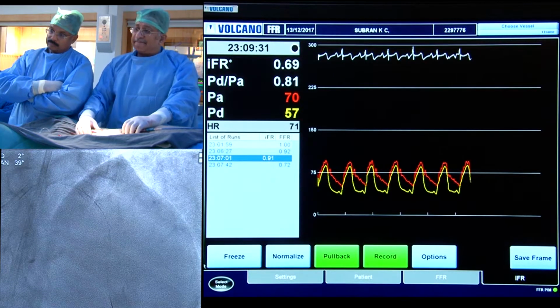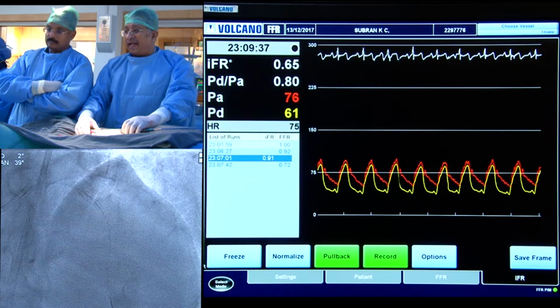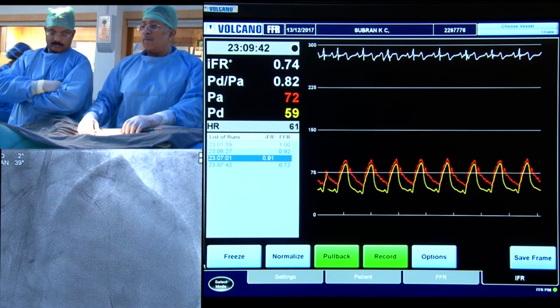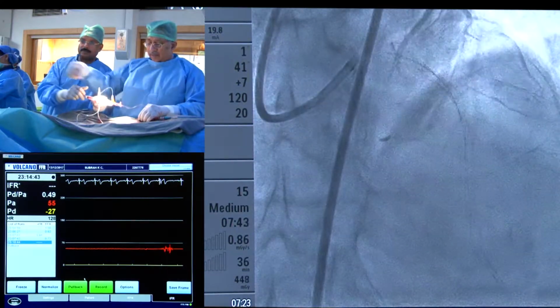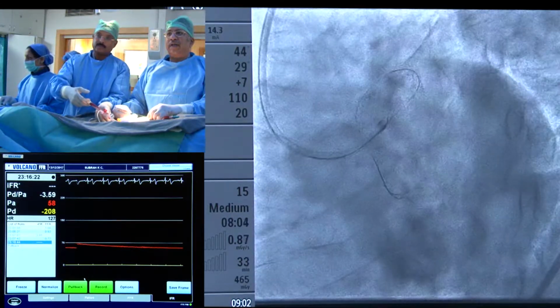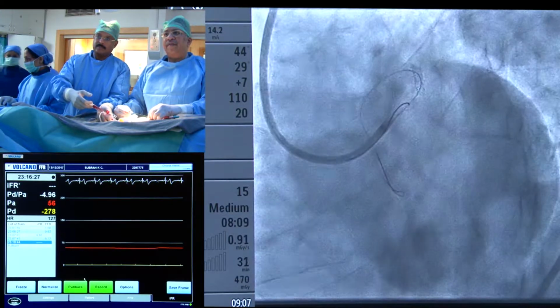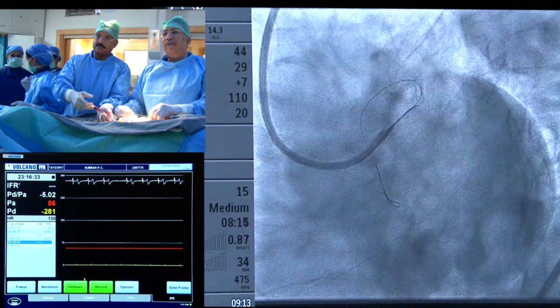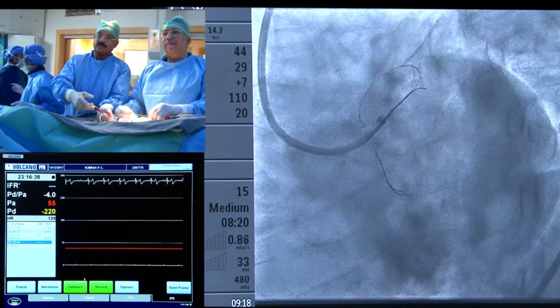But before that, let's also do an IVUS study of the left main, LAD and the circumflex to the left main. So now we have crossed the left main to LAD with a BMW wire, and now we are crossing into the circumflex and the ramus. At this point, I think we must take care that we do not intertwine the wires a little too much, otherwise we will land up in a problem.